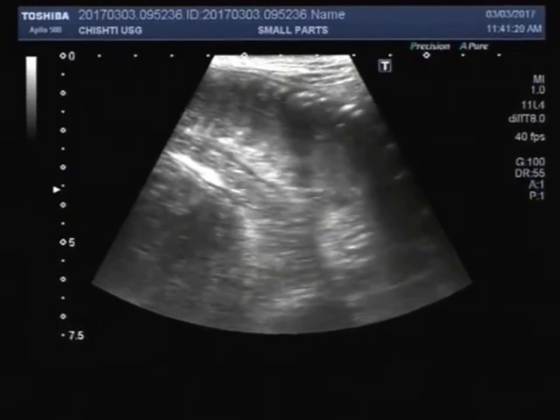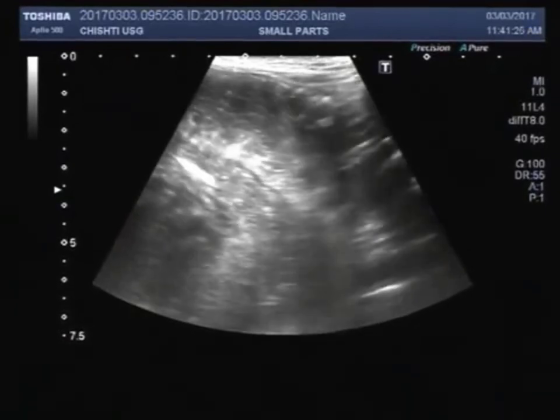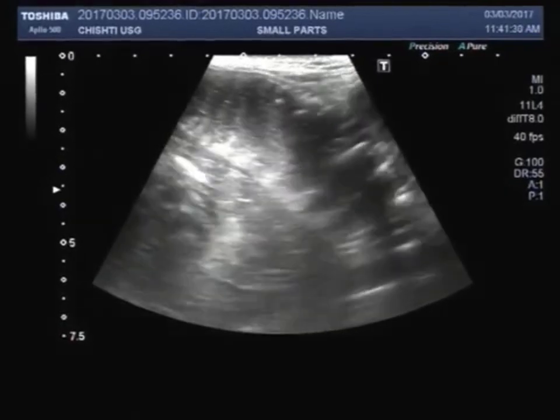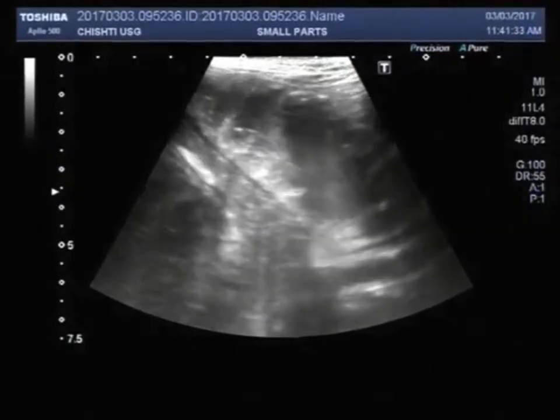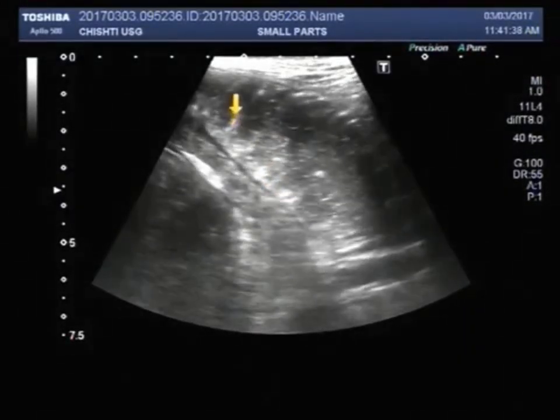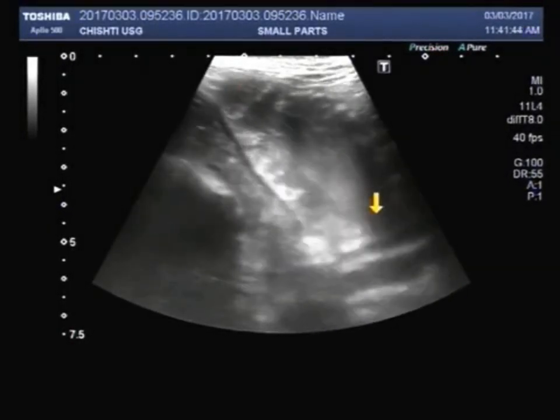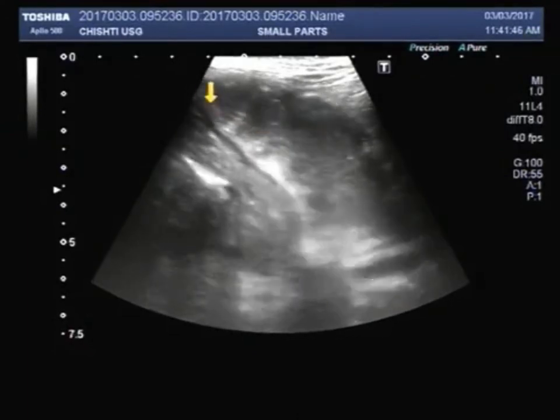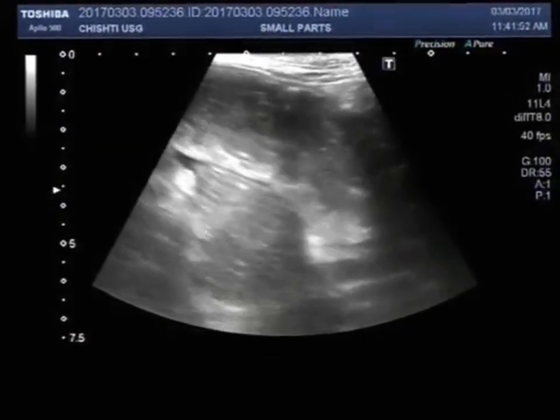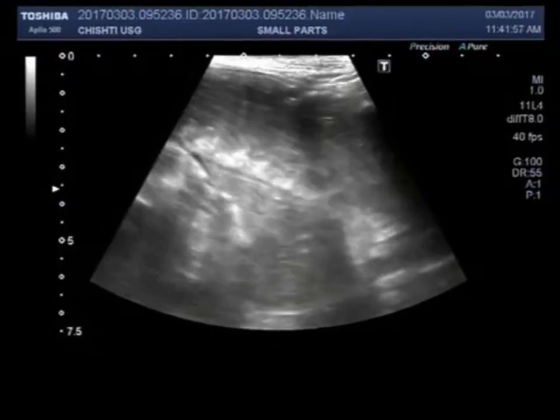We see increased peristalsis like this one, with back and forth movement. That increased peristalsis with back and forth movement means the obstruction is very recent, I mean less than 48 hours. Because eventually, with the passing of days, this peristalsis will go down, sometimes even stop, because it's a muscle, and it can get fatigued as well.